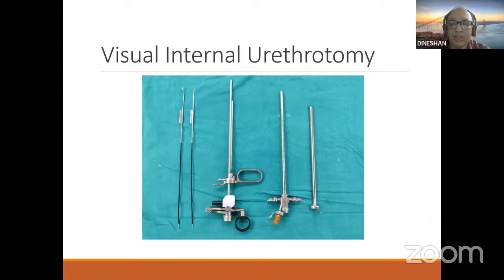The components: this is the working element, the passive working element used for the TUR set. You can have either a single stem or a double stem, and depending on that you can have the knife also. These are single stem knives. You can have a double stem knife also. These are the common types of knife you use.